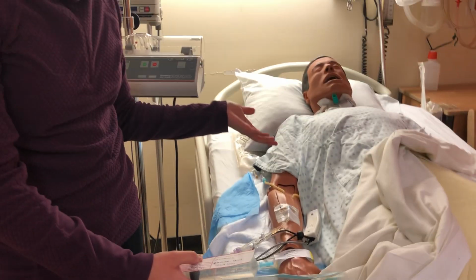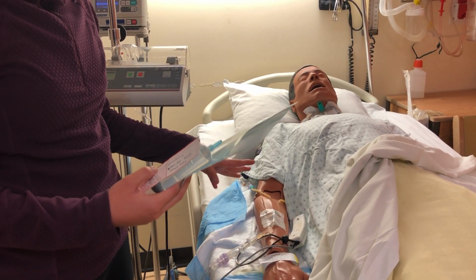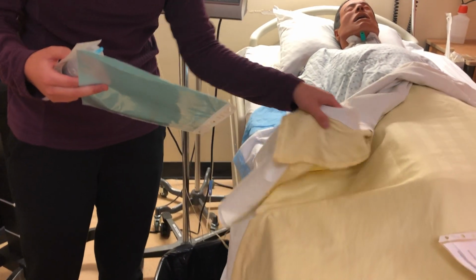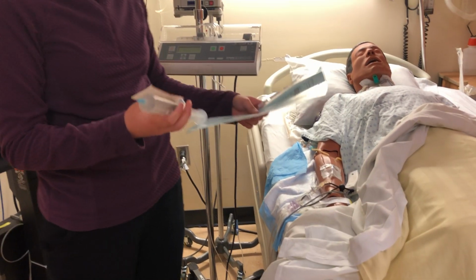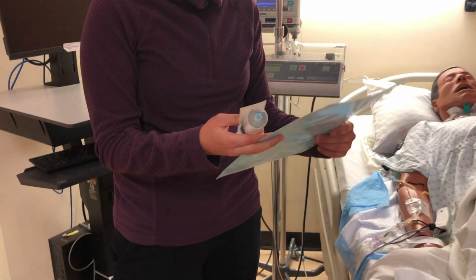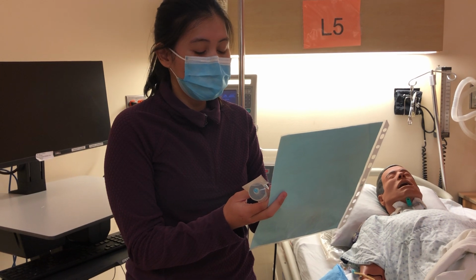Any allergies? No? Okay. So I just need to do my third check here at your bedside. For the third check, I'm going to be using the patient's armband compared with my MAR and my final medication here. So we have here patient Tyson Ward. The medication is fentanyl. This is fentanyl. The dose is 10 micrograms.